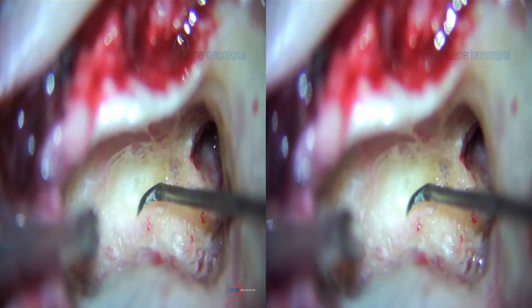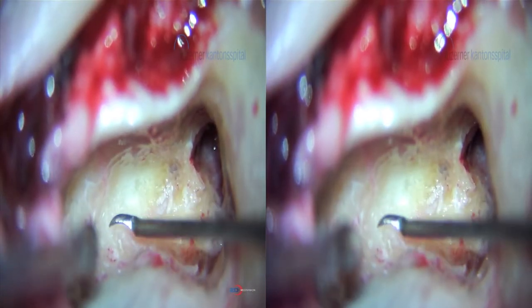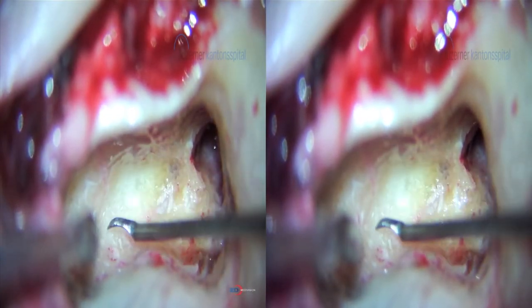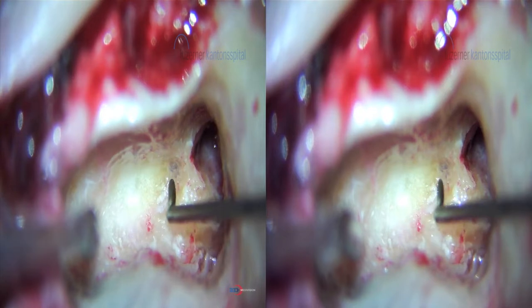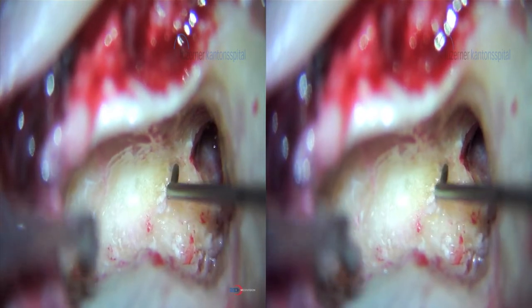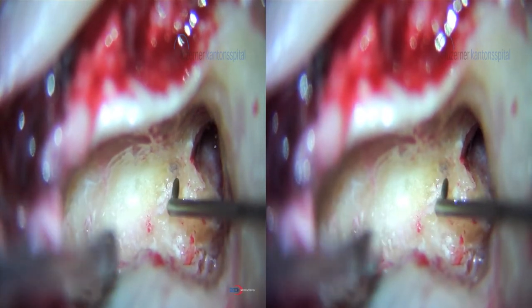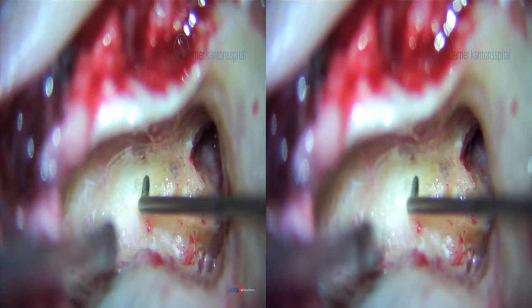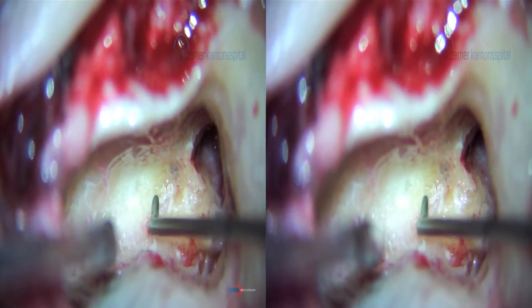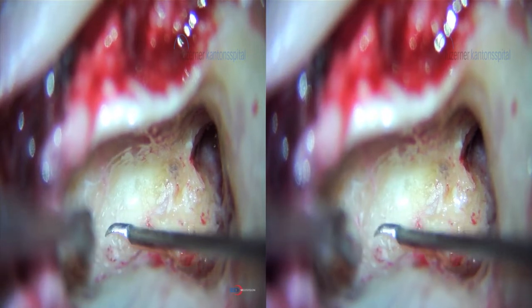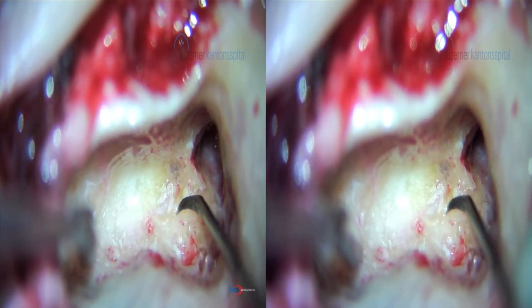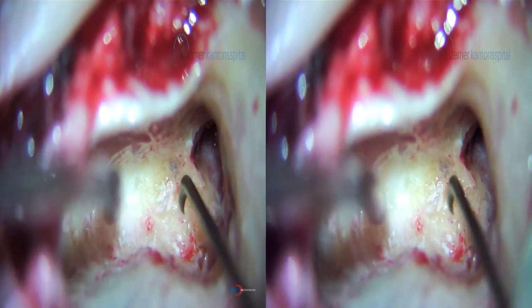You can see nicely here the area of the facial nerve, the sensory branch going to the posterior canal wall coming from the lower cranial nerves, and here the area of the posterior tympanotomy, which is quite sclerotic in this area.